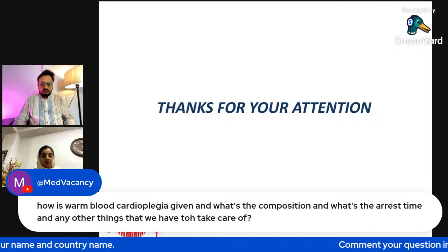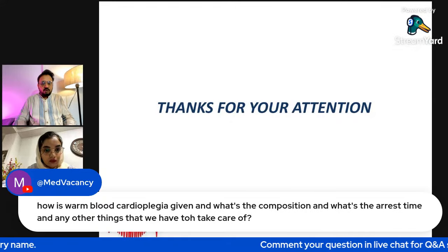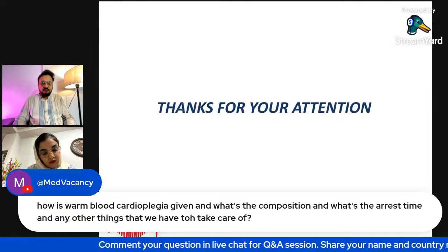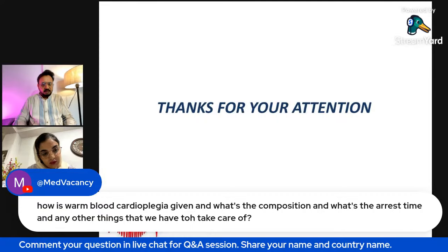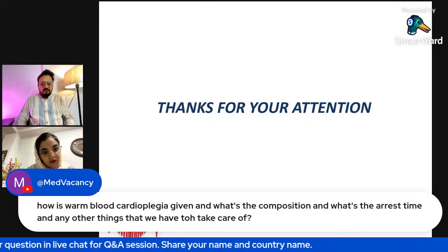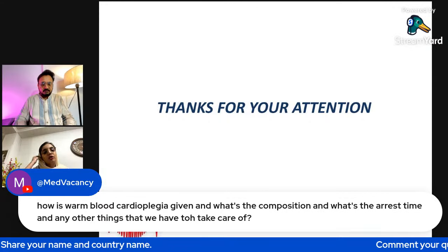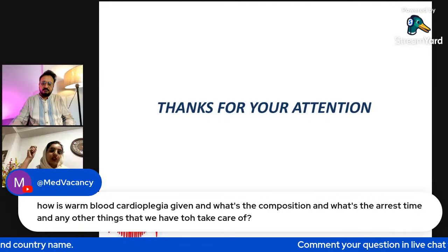We have one more question. How is warm blood cardioplegia given, what is the composition, what is the arrest time, and is there anything else we have to take care of? For warm cardioplegia, we just inject blood.